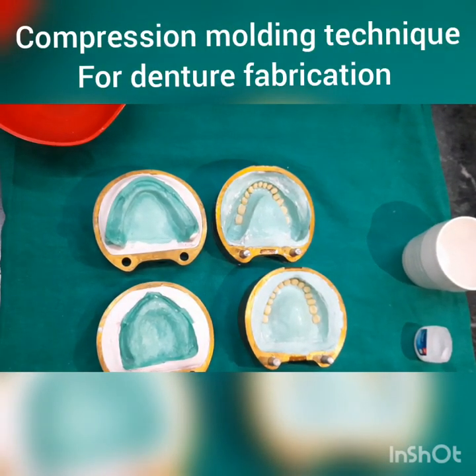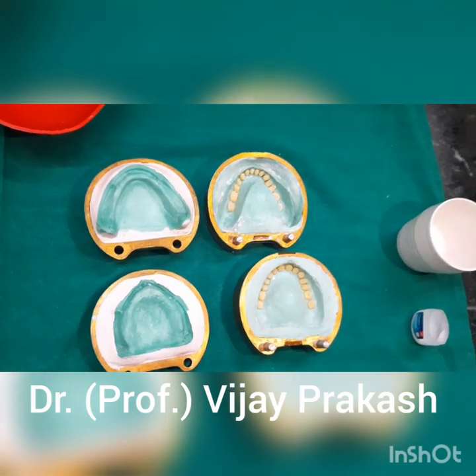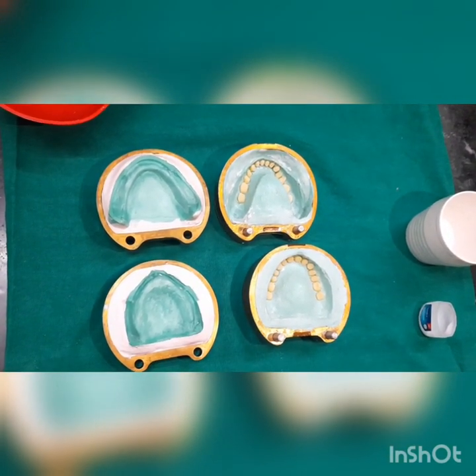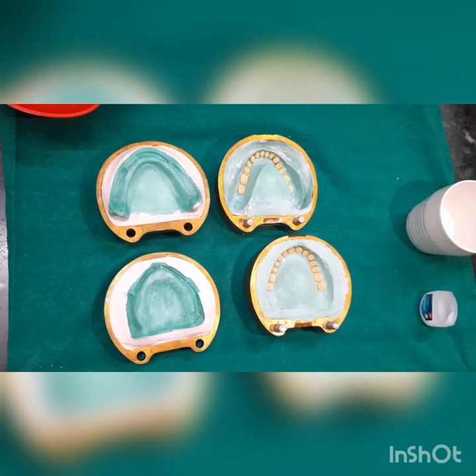Good morning, I am Dr. Vijay Prakash. Today, once we have completed our wax elimination procedure and applied cold mold seal, the next step is we have to do packing of heat cure resins.